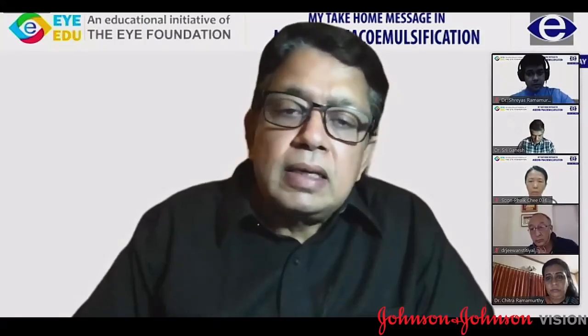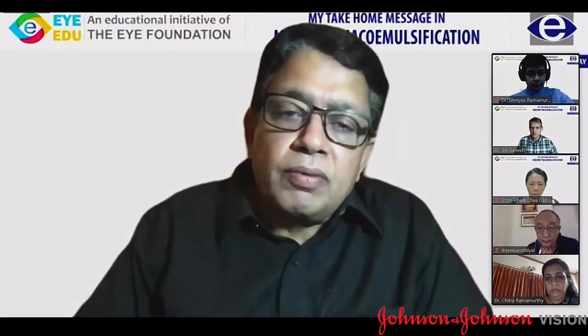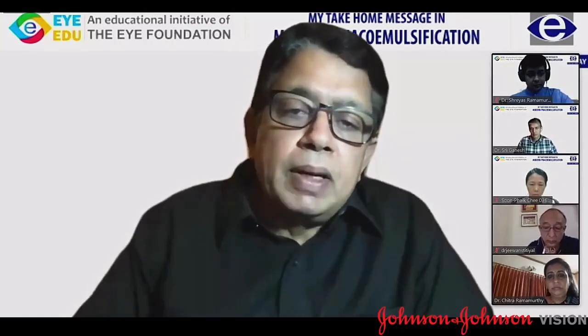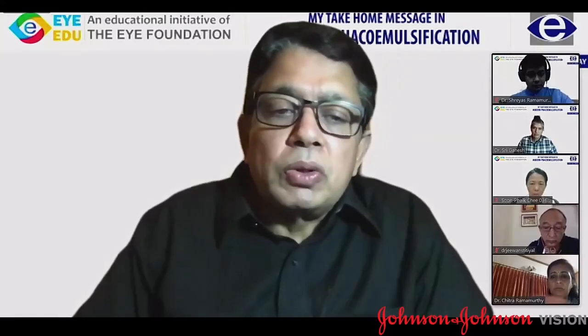And I think each and every one of us should ensure that at least 95% of our normal patients end up with less than 0.5 diopters of residual spherical equivalent error. And I think toric intraocular lenses will also play a big role in achieving that. If any last comments, otherwise we'll go on to the next speaker.